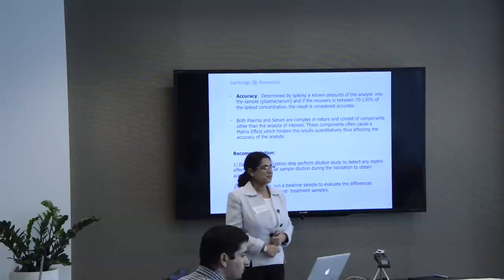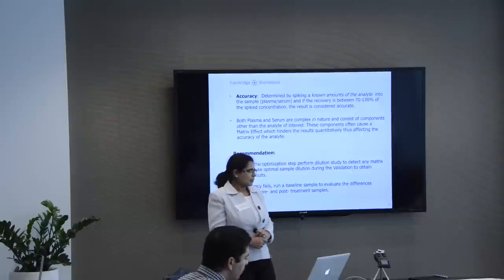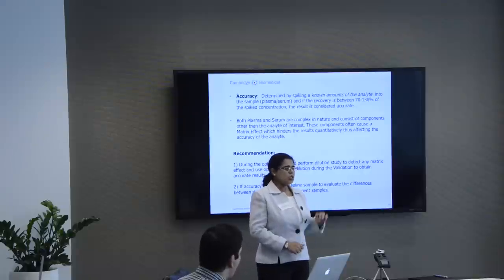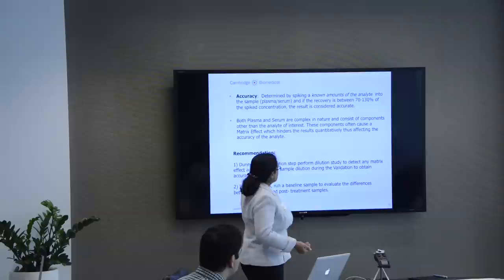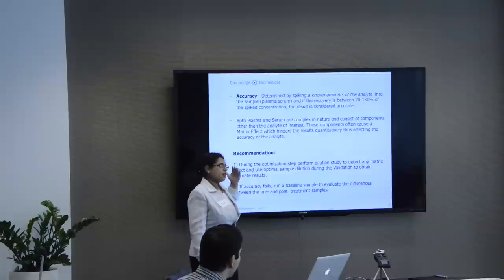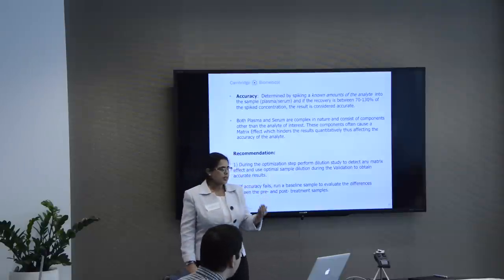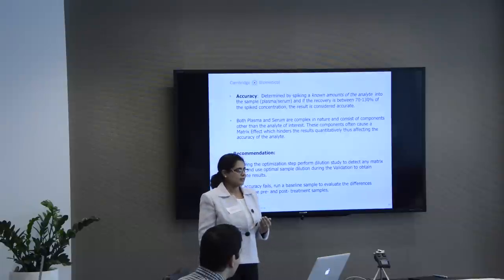So when you say it works, when doing the dilution, what do you mean by that? Do you mean that the spike and recovery in those samples is good? Yes. Okay. Because when you are diluting down the sample, you do a spike and recovery, you can actually recover between the recommended 70% to 130%. So that means whatever result that you will get from a patient sample when you do the analysis, you will get an accurate result.